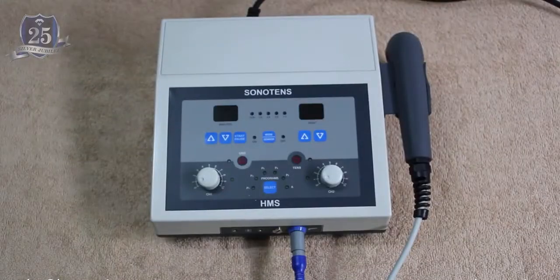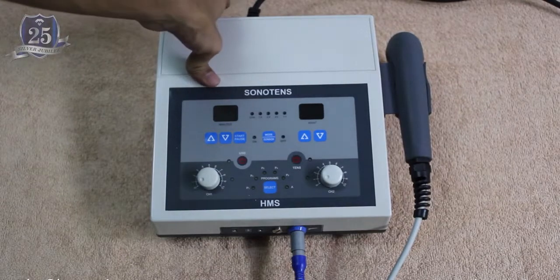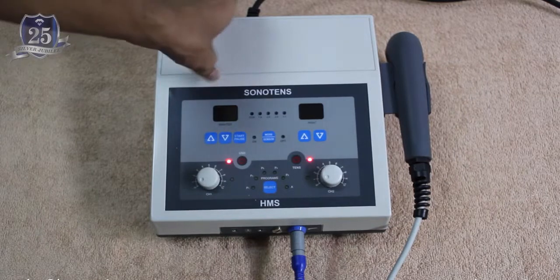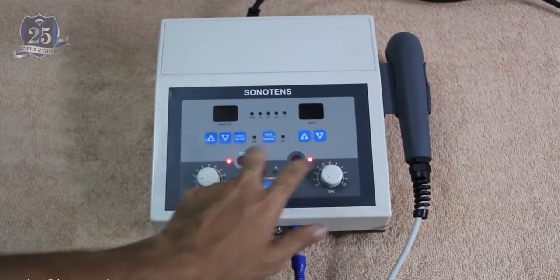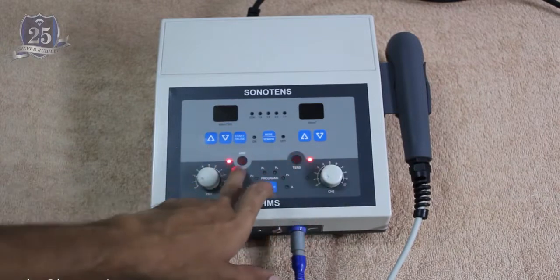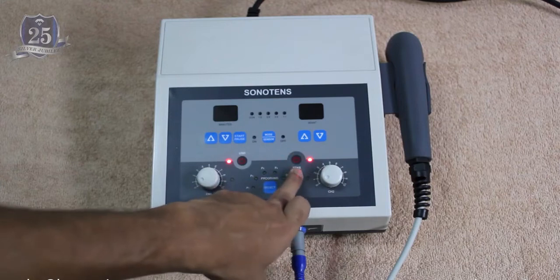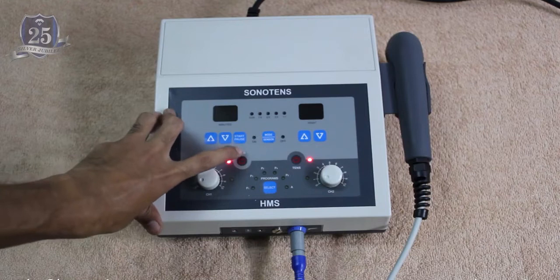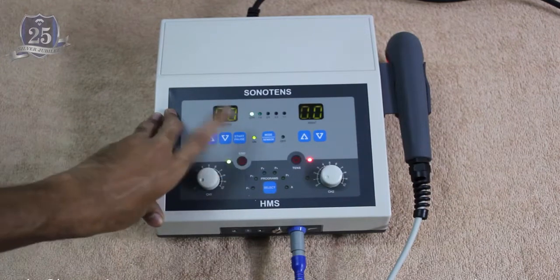Switching on the machine is very simple. You have to plug in the power cable to the back of the machine, and you will have a power button to the back. You just have to switch it on, and now the machine is on. So you will be having 2 different power buttons to start ultrasound separately and TENS separately. So this one over the left is to start up the ultrasound, and to the right it's to start up the TENS. Okay, now we'll be starting it with the ultrasound first. Now this button is used to start ultrasound.